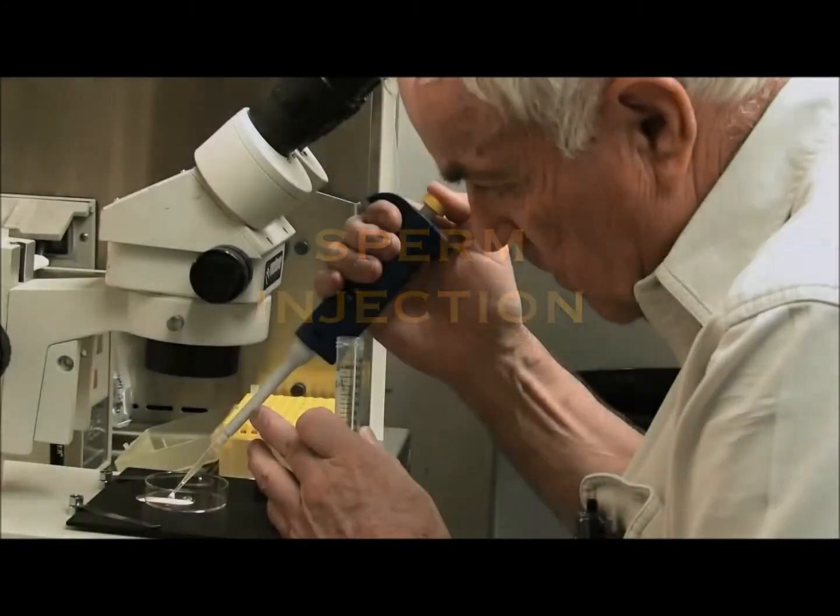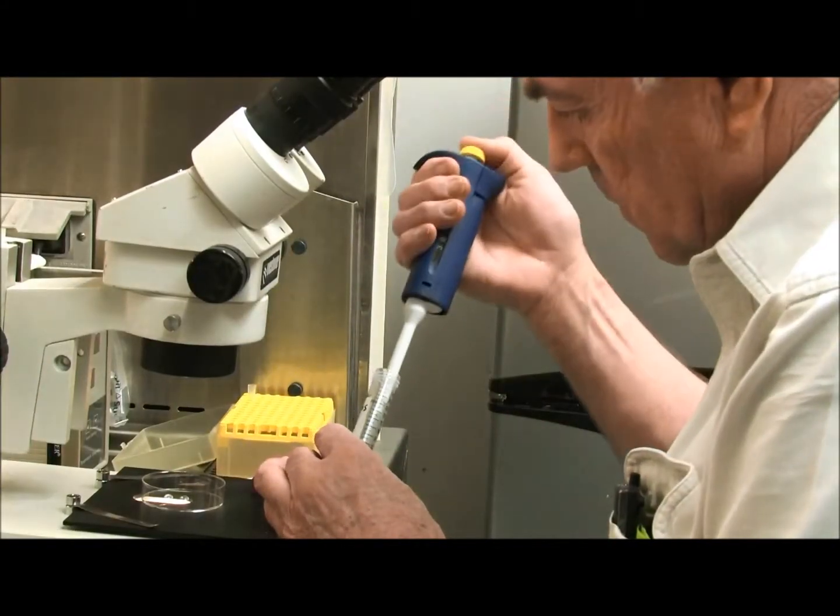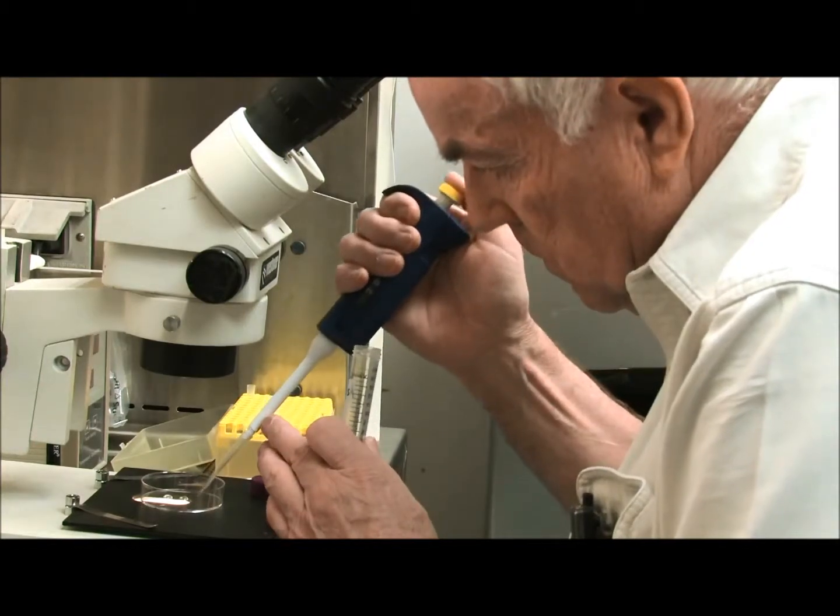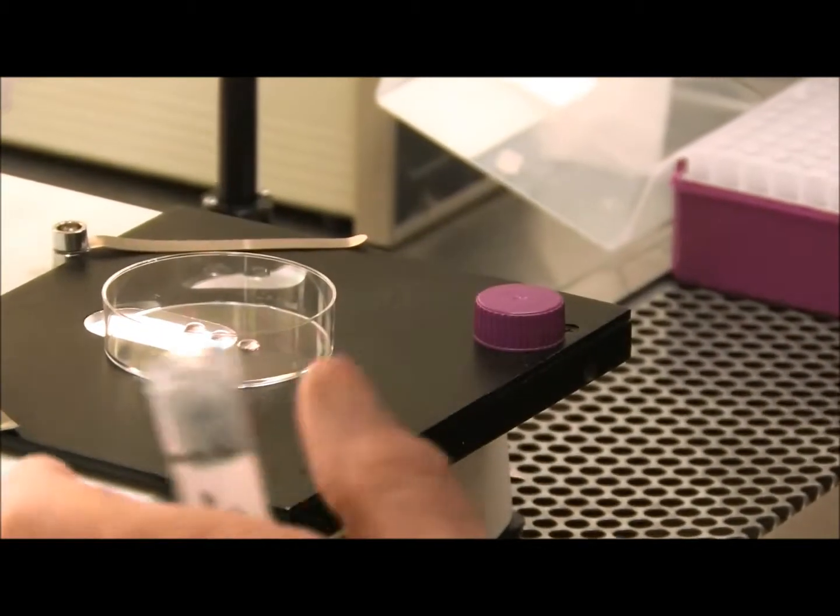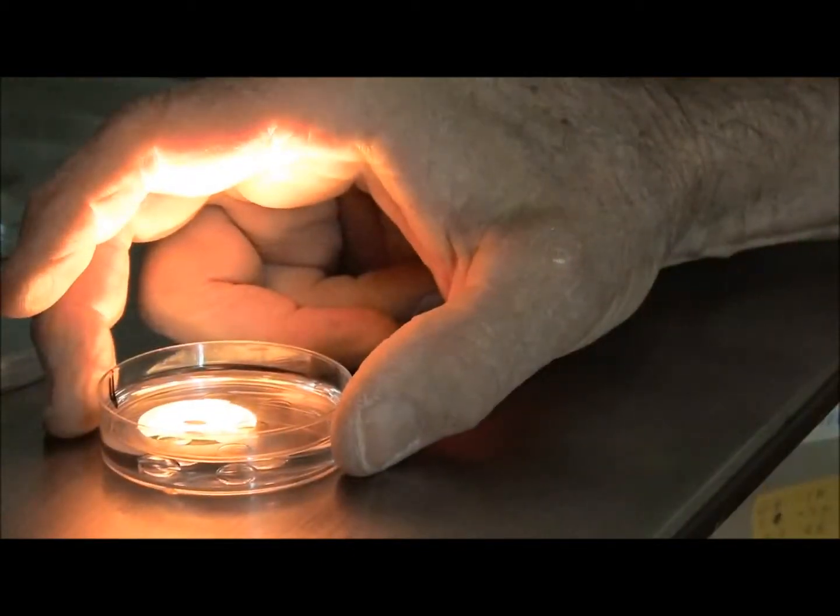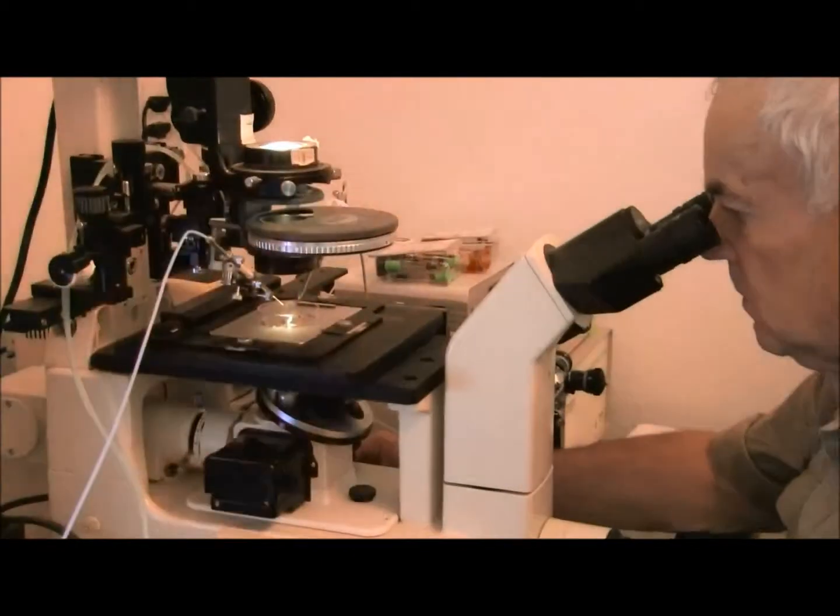The actual sperm injection is accomplished in a small dish with drops of media in which the egg is placed in one and the sperm sample is placed in the other.